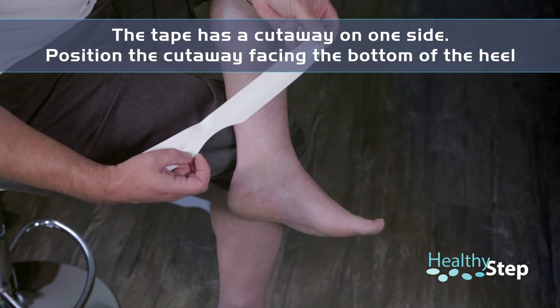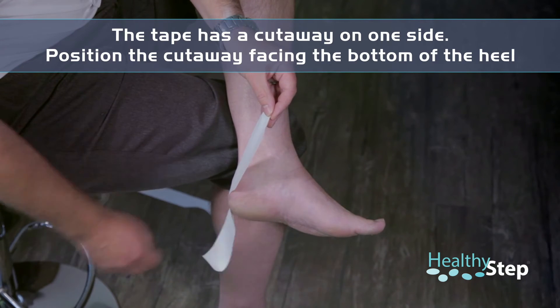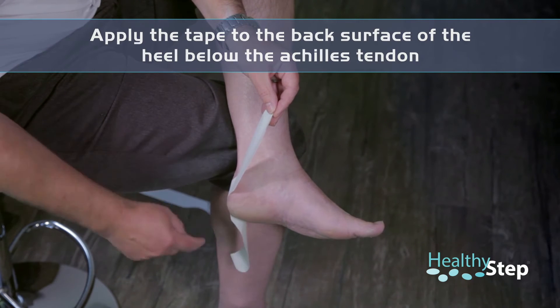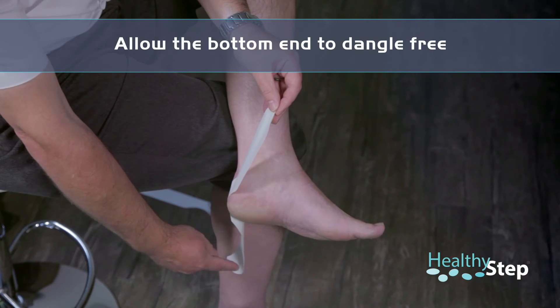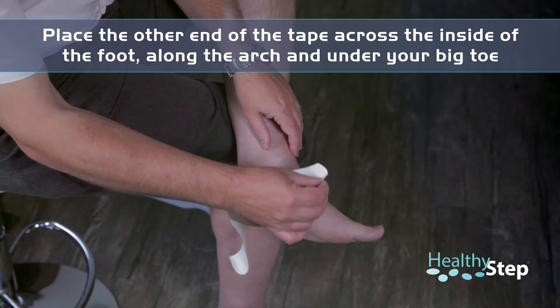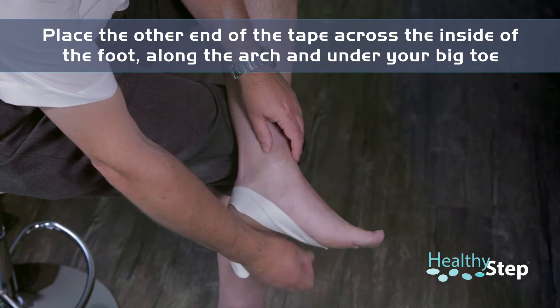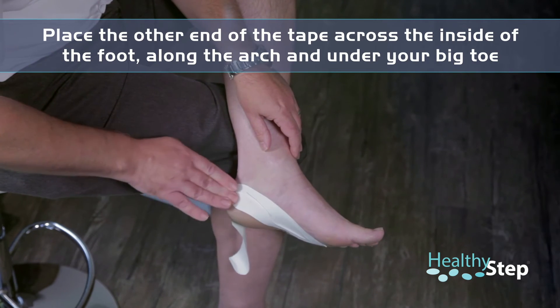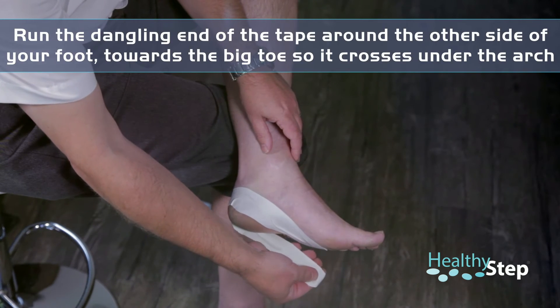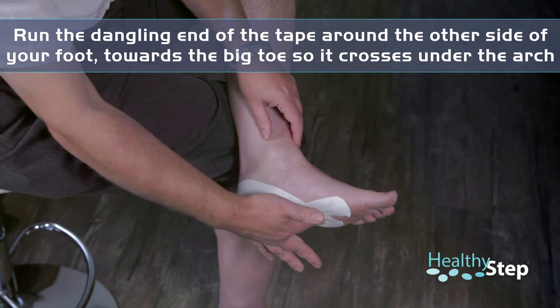The tape has a little cutaway on one side, and that needs to be facing the bottom of your heel. Apply the tape to the back surface of your heel below the Achilles tendon and allow this piece of tape to dangle free. Now concentrate on the first piece of tape running upwards, moving it from the inside of your foot running under the arch towards your little toe. Don't worry if there's the odd crease. Now take hold of the other piece of tape and run it from the outside of your foot towards the big toe, so that the tape crosses underneath the arch of your foot.